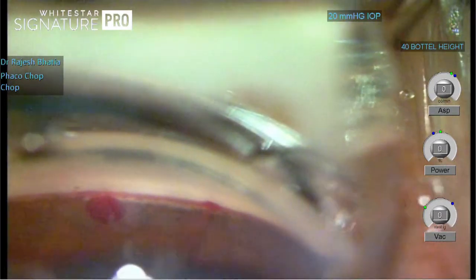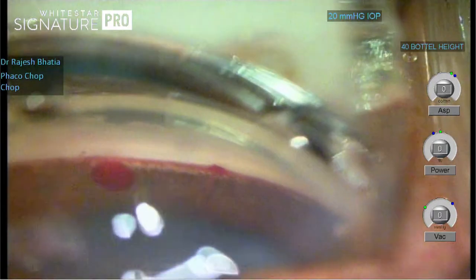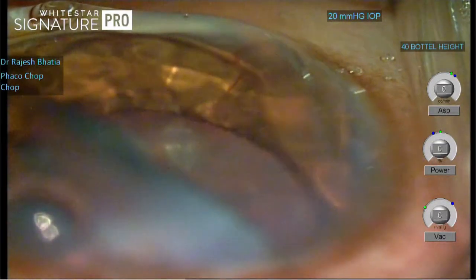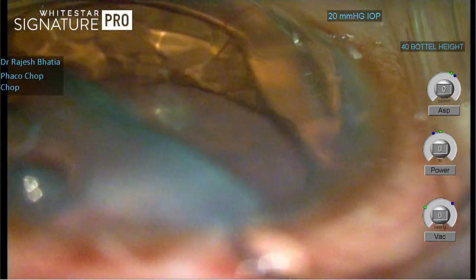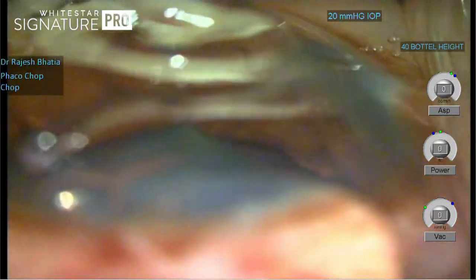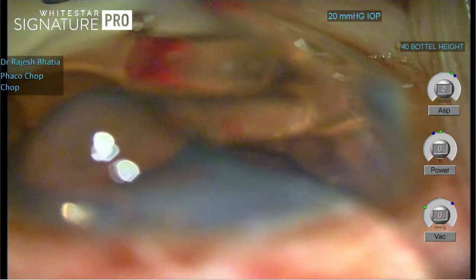Okay, now once I'm again closing the insertion sleeve before coming out, I'm just going to fill the AC with a little more cohesive viscoelastic to show the proper placement of the stent. Okay, I'll put the prism. Prism, Devi ji. So what becomes challenging is working extraocularly with such a high magnification in place.